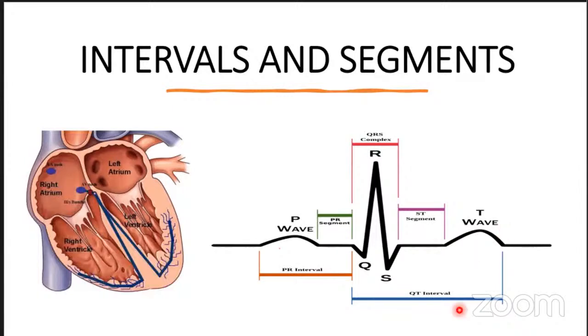Again, we would look at what the normal should be, but always remember on the NCLEX, if I see a prolonged QT interval, what does it tell me? It could tell you your client has low calcium levels.